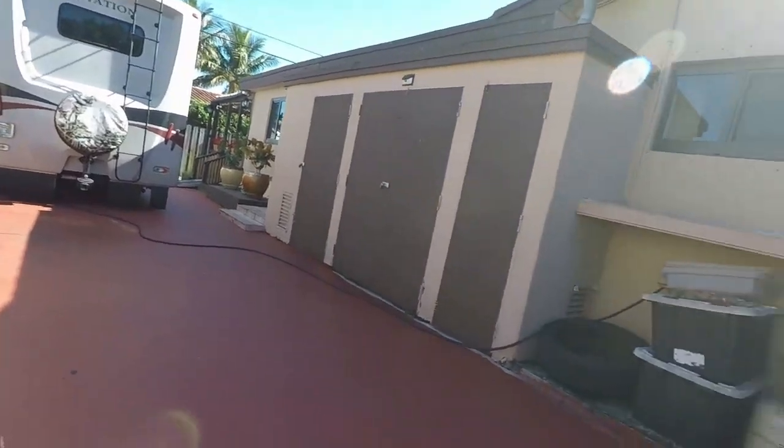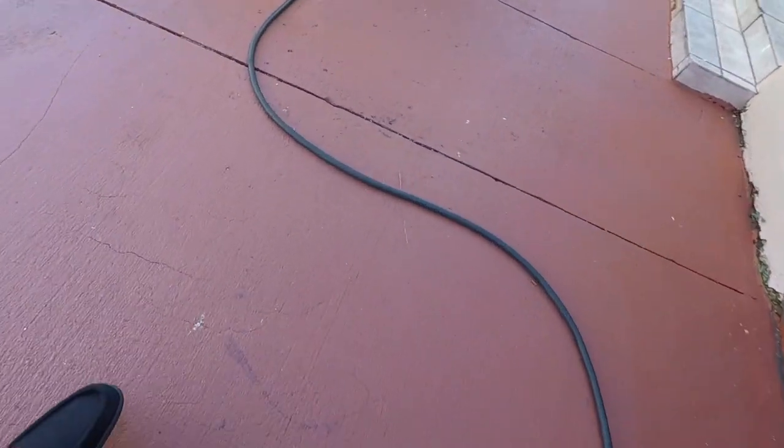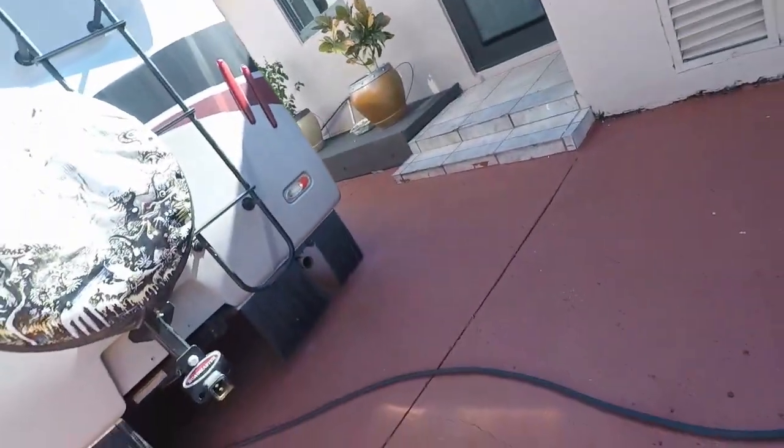My grandmother has this RV and she has this thick line going right there. I've actually almost fallen because the front wheels don't go over it. But even a little wheelie with one hand gets those front wheels up and over — it's okay, you can do it.